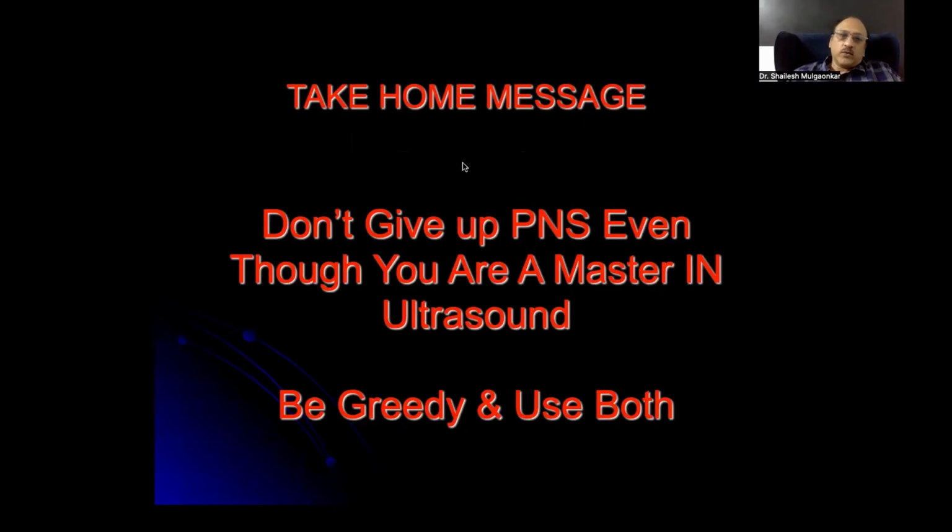So now what is the take-home message? Don't give up the peripheral nerve stimulator even though you are a master in ultrasound. Be greedy and use both.